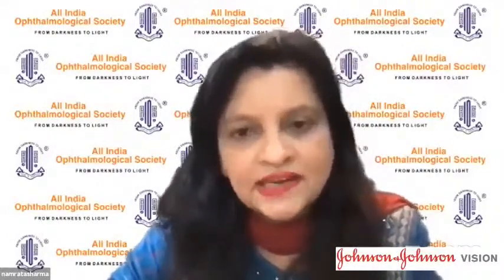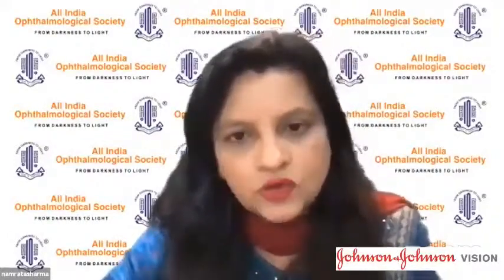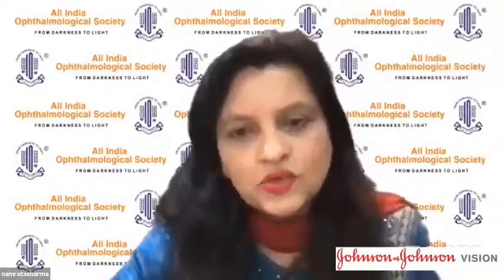And you may not be able to do femto in extreme subluxation, which is just jump to one side. And you can't center it also, because how far will you go? Because the lens is only, half of it only can be seen. So I think it's a great technique in those kind of cases. Thank you. I think we should move ahead now.